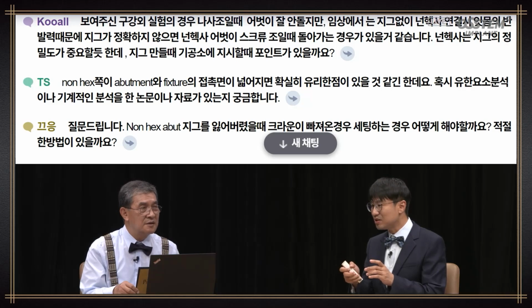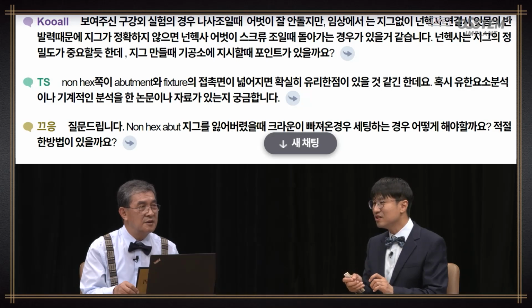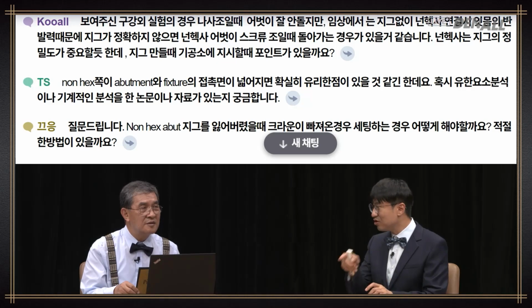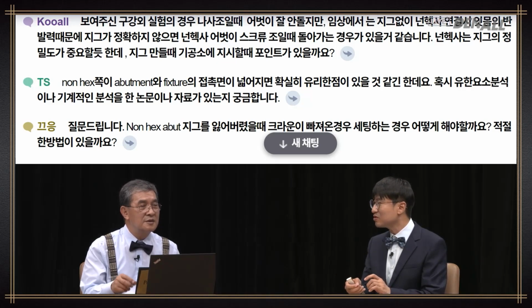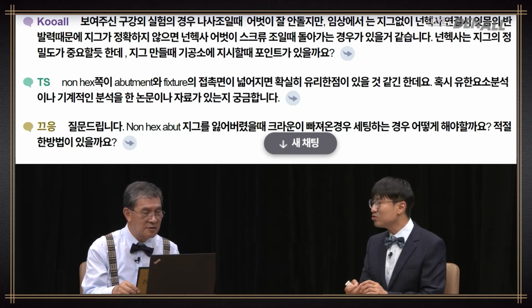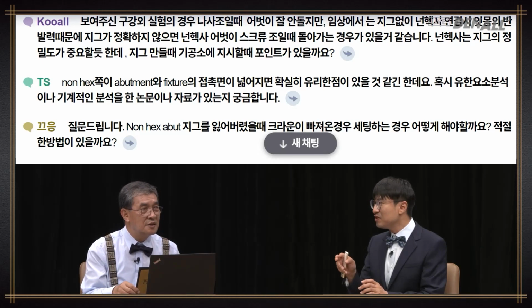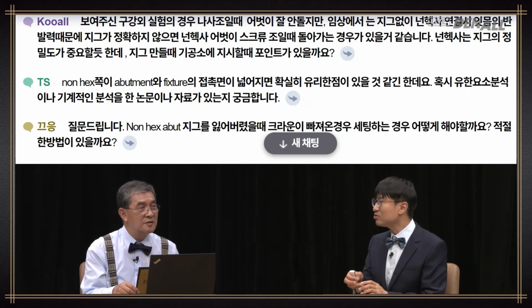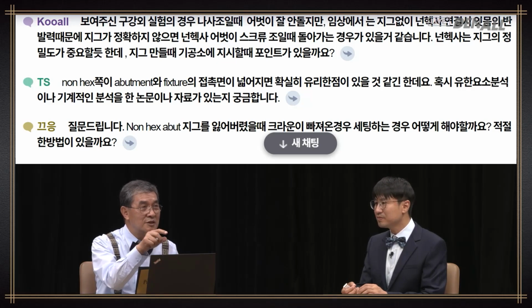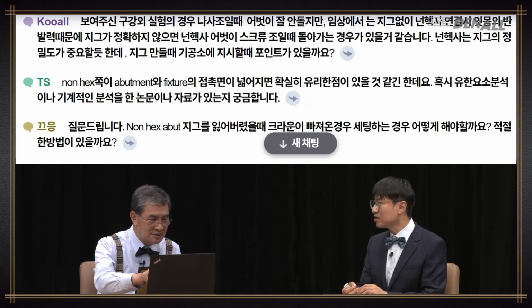I put the jig on the occlusal table of the mesial tooth. I don't just put it on top. I have my staff press upon it with forceps. I have the patient press upon it in order to prevent jig movement. Setting it is important, but the important thing is to be able to have the patient press upon the jig with forceps. You need to have the right position. I place the jig on the occlusal table side. Understood.